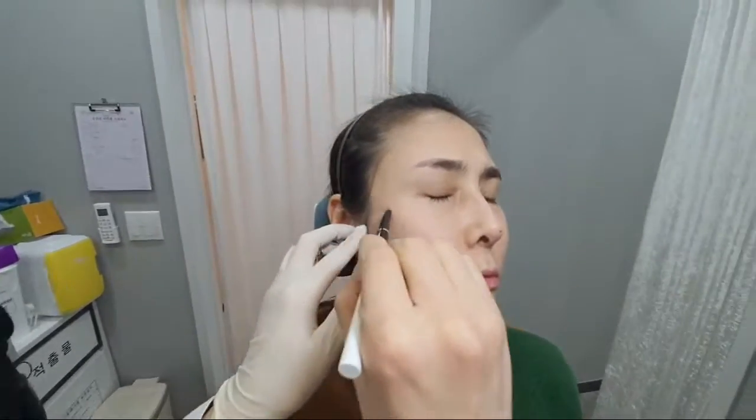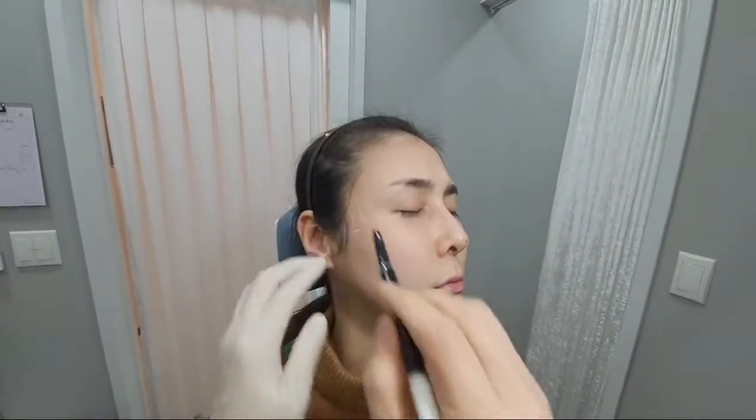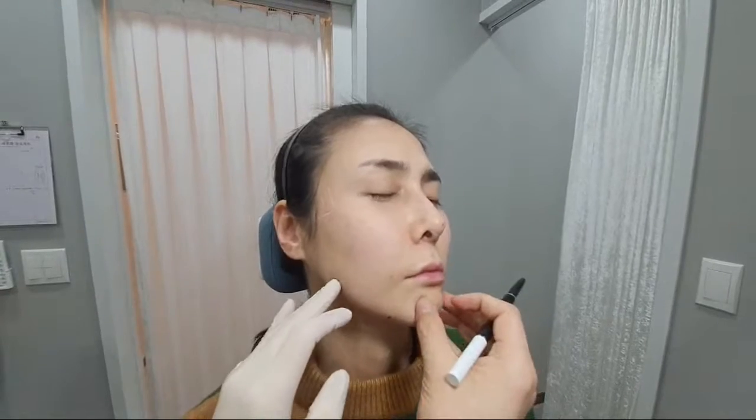뒤로 기대면 돼요. 조금만 내려보세요. Using a designing pen to draw an overlay of the area, the point of injection for the threads. We're going to be moving on to the threads.